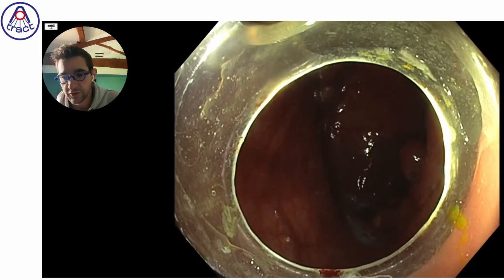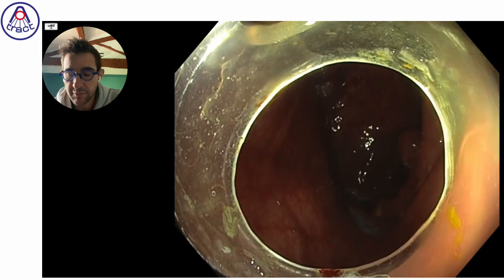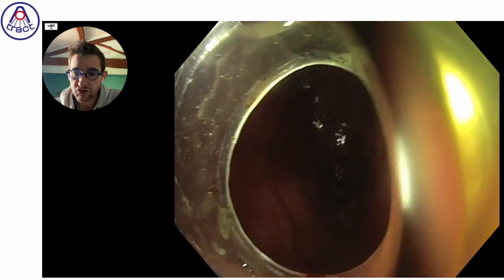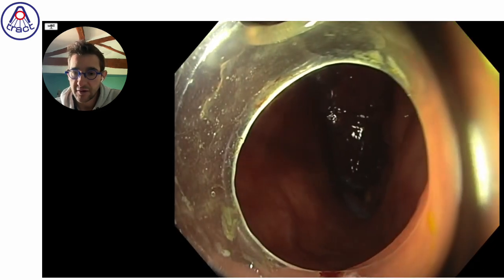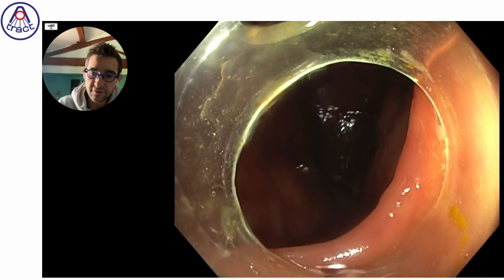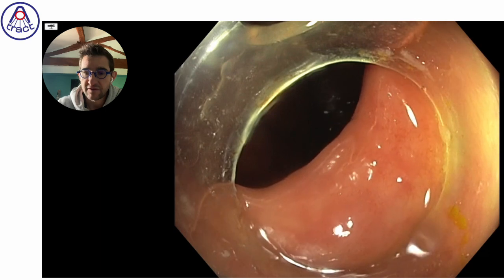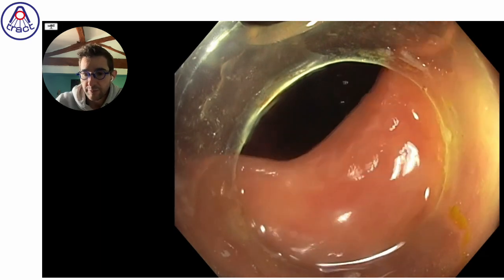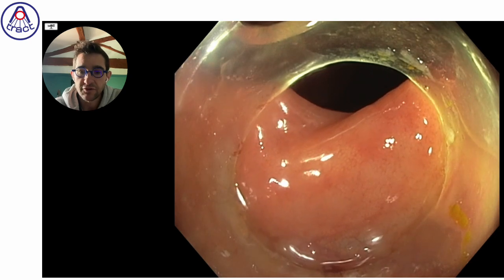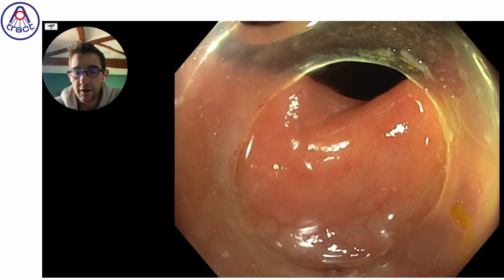So we had to remove the device and use the good small 1.8 millimeter forceps to bring the traction device in the area. So unfortunately, twice because of the bad device chosen by the assistant, which should be for waste management and reducing of our waste and our device consumed.